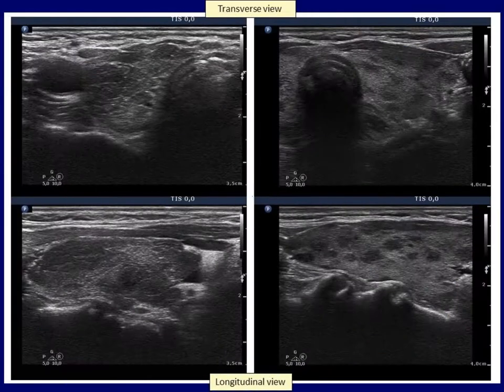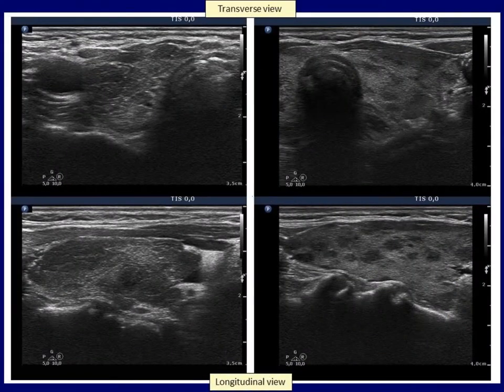Both patients had Hashimoto's thyroiditis and presented with the most common form of this condition. Both the larger hypoechoic areas in the left case and the smaller discrete lesions in the right case should be regarded as more active foci of the disease and not as pathological nodules.